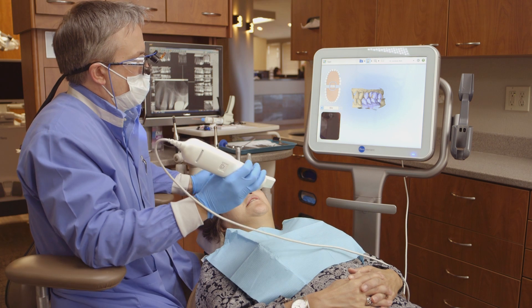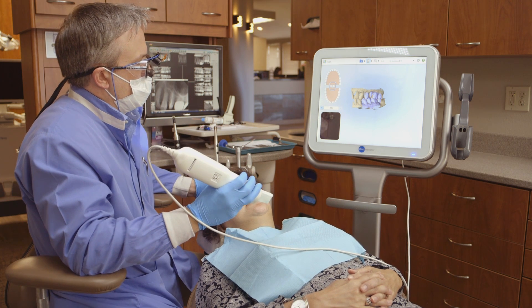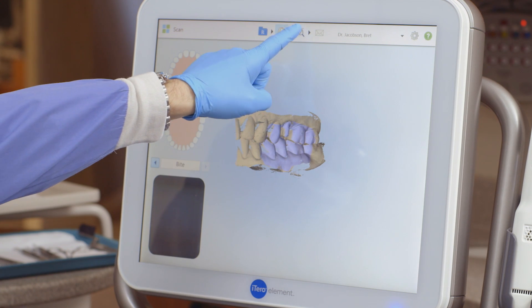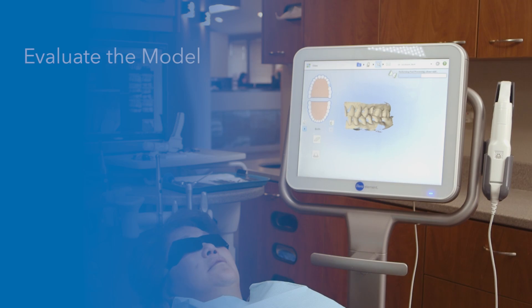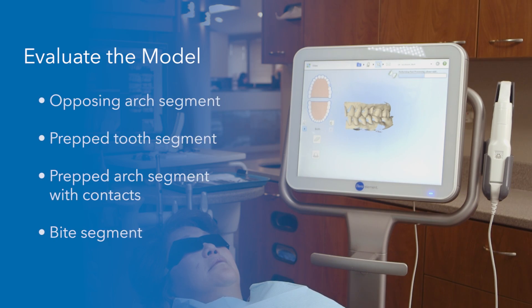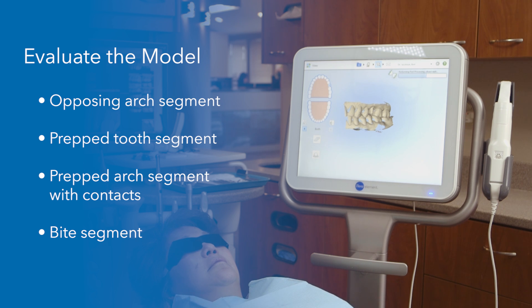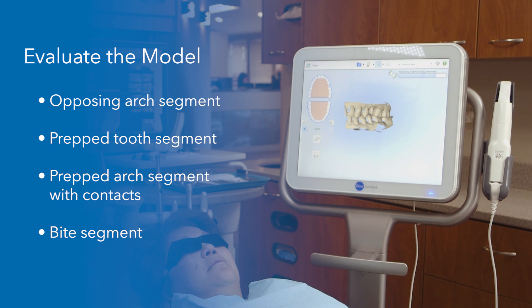Once I have completed all the required segments, I'll tap on the view icon at the top of the touchscreen display to view my digital model in high resolution. Once the case is processed, I will evaluate the model to ensure that it's accurate and complete. It's necessary to check the opposing arch, the prep tooth, the prepped arch and contacts, and the bite.